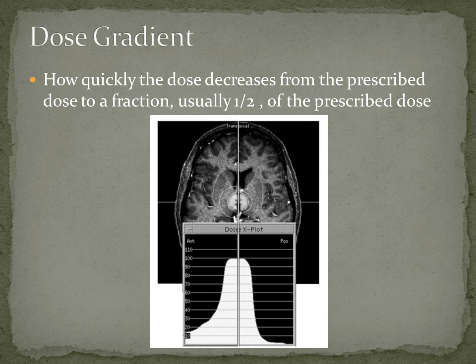Okay. Just another example, just to drive this point home and drive it into the ground. I have a patient, same target. I just split the scan left and right, and on the right side you see a dose distribution which falls off very rapidly. On the left side, I've created a dose distribution by not following the rules that I need to follow to create these spheres. I've created an inferior distribution that falls off less rapidly. If I do that, again, it takes longer to get down from my target dose to my non-target dose, and these tissues out here are getting substantially more dose than they are on this side with the good dose gradient. Okay.